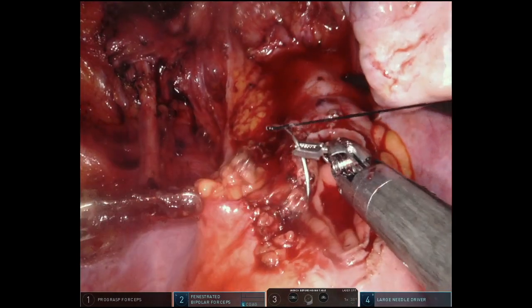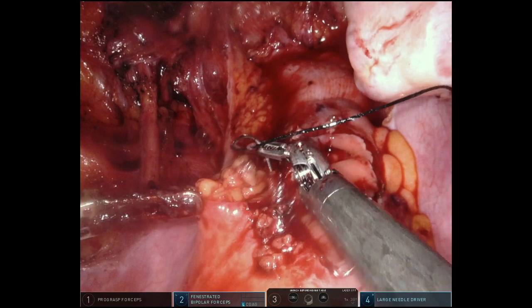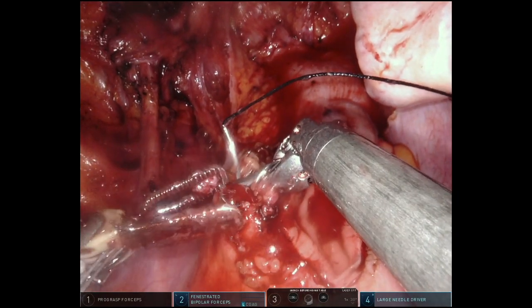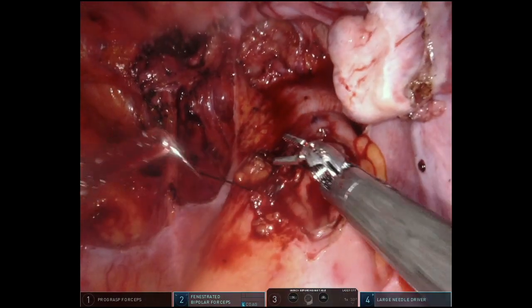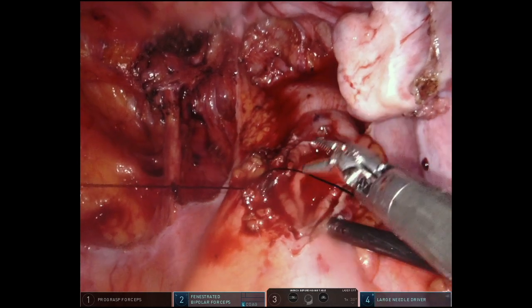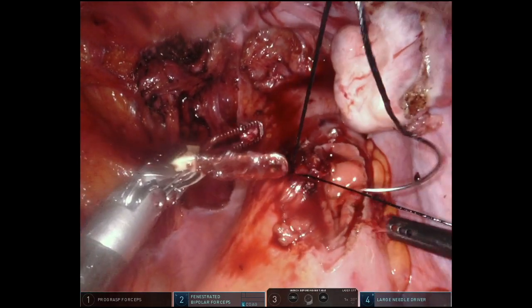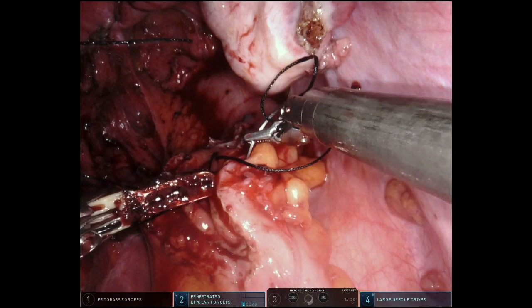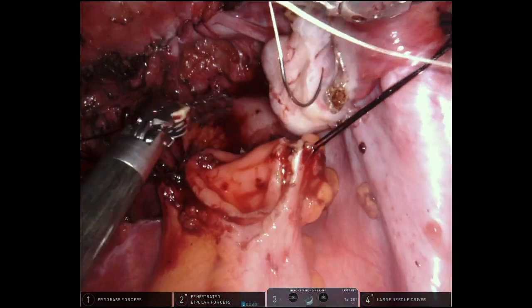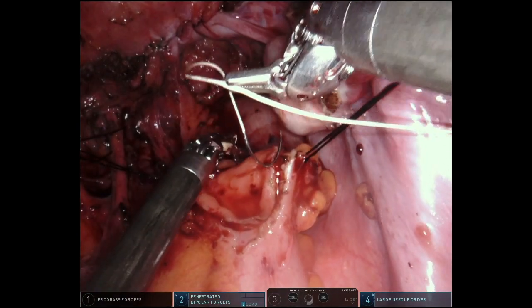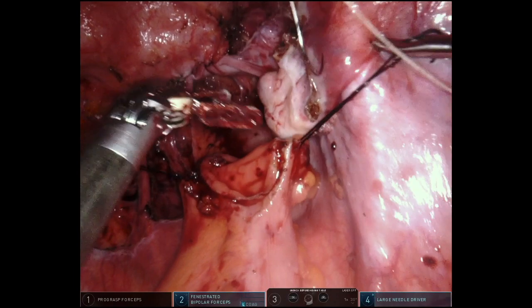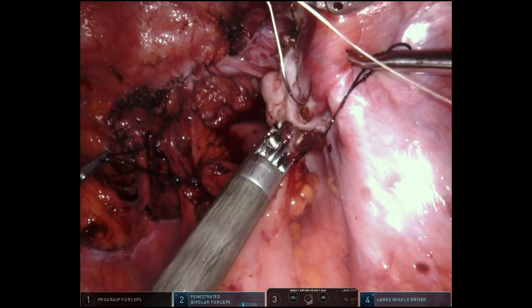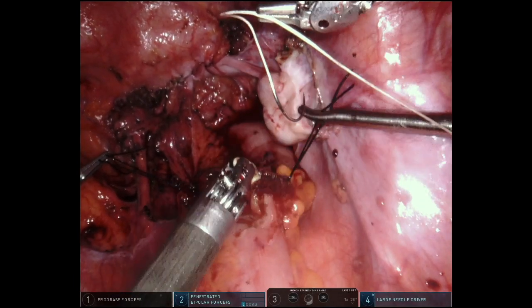The suturing begins with placement of 3-0 silk sutures at 3 and 9 o'clock corners of the incision. The placement of these stay sutures allows us to orient the bowel transversely and ensure that we create a closure that is entirely perpendicular to the lumen of the bowel. With the left suture in the third arm and the right suture in the assist port, we now have the bowel oriented to begin our two-layer closure.